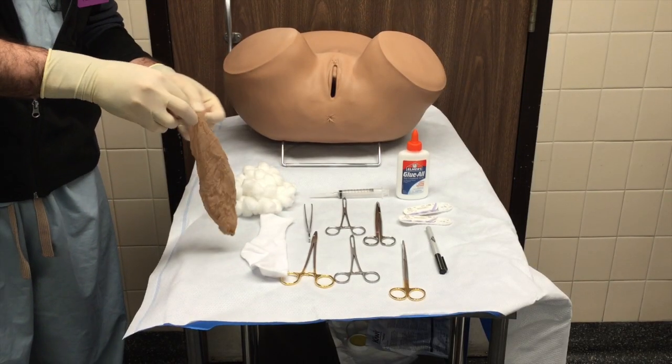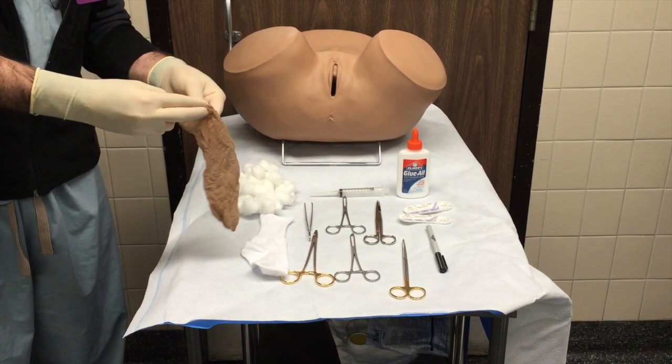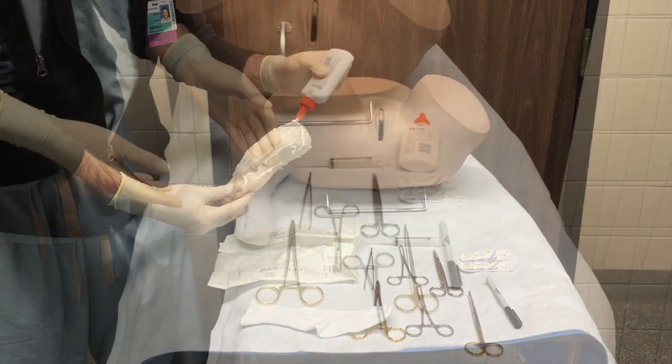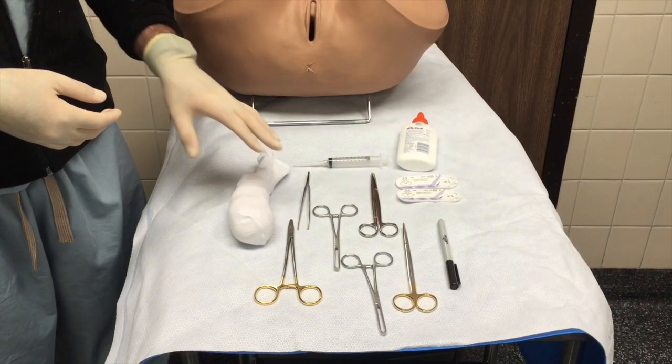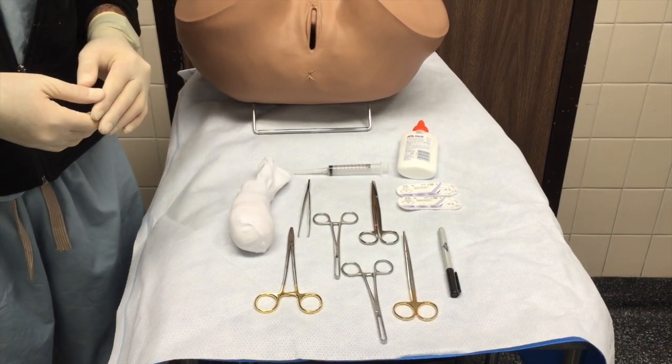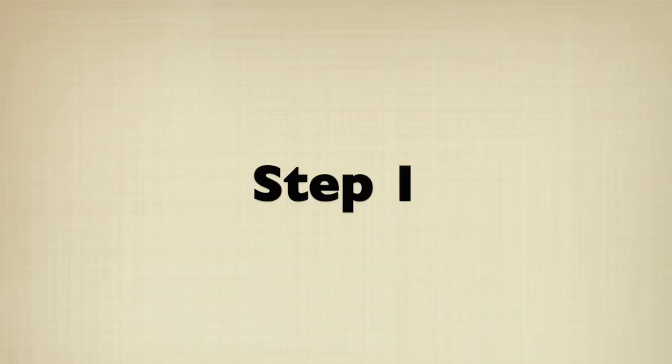To set up the model, we stuff the cotton balls into the pantyhose, representing the fibromuscular connective tissue, as seen here. Glue is then copiously applied to the fibromuscular connective tissue and used to cover the lace sock — the vaginal epithelium — as depicted. Once constructed, we are ready to begin the procedure.